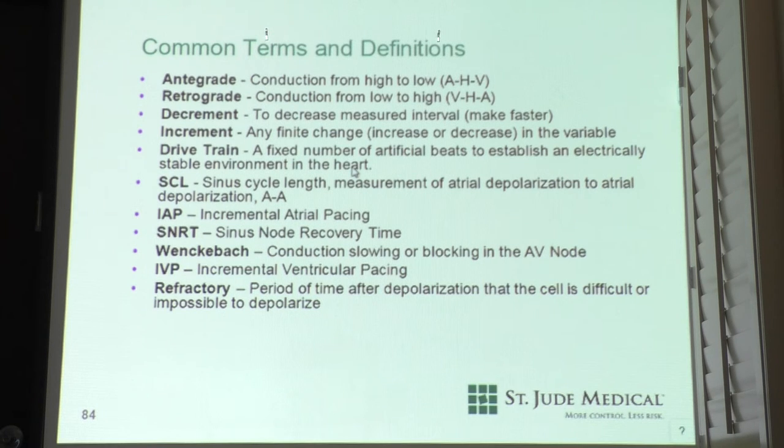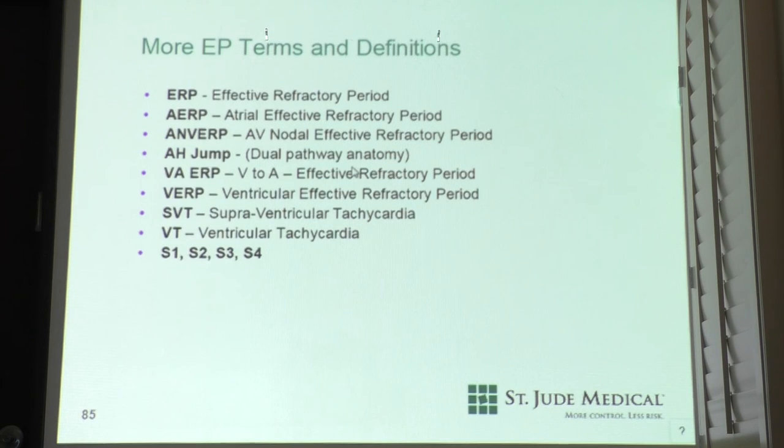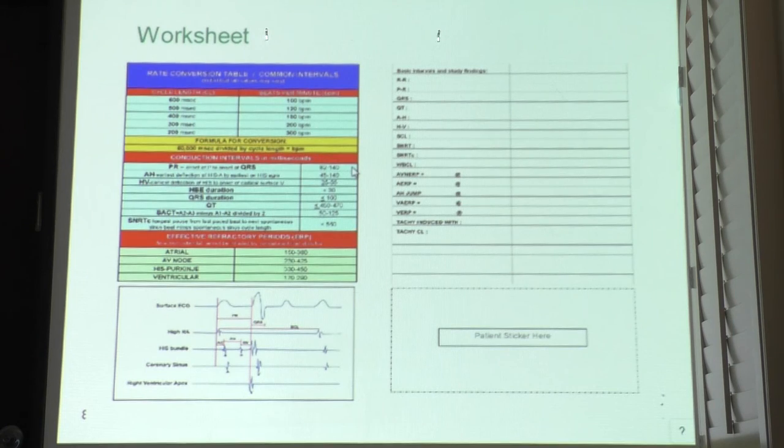Actually, we can cover these in a bit. We know about Wenckebach, right? It's one of the types of AV blocks, right? It's the type 1 or Mobitz type 1. There are different conventions for how they're naming them now, I've noticed. But Wenckebach basically means that you're getting short, longer, longer, drop; short, longer, drop. And we'll cover other things when we get to them.